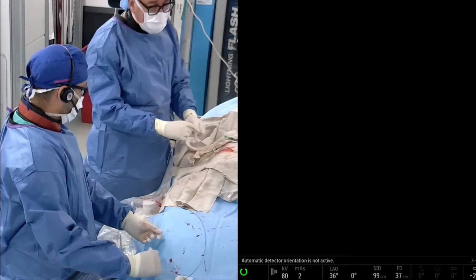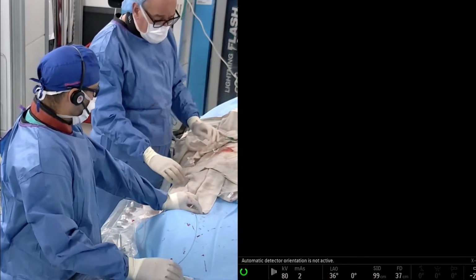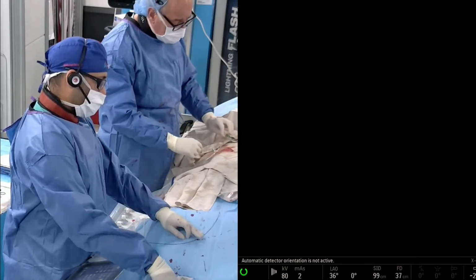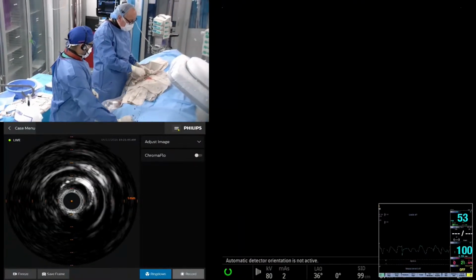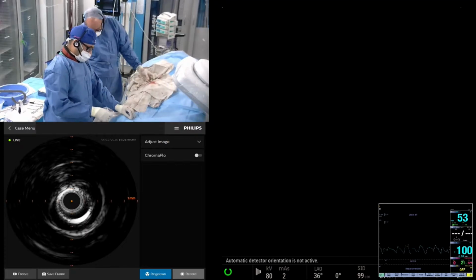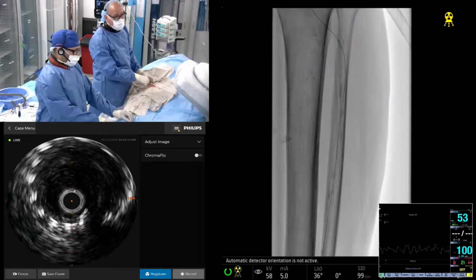There's certain people I think that use optical coherence tomography, but I think you really need to be thinking about using intravascular imaging when you're doing these cases, especially BTK cases. I think if you're going to provide bailout therapy in the form of a scaffold, that you have to have it properly sized. I think that's absolutely critical.